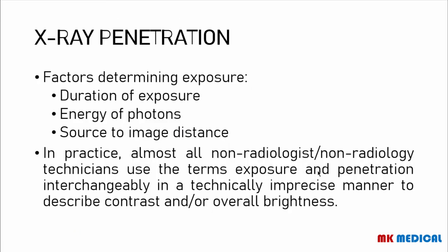So the last principle that we need to look at is X-ray penetration. The factors that determine the exposure of the X-ray film are the duration of exposure, the energy of the photons, and even the source to image distance. But these are technical terms that are going to be understood by radiologists and people studying radiology. For clinicians, I don't think this is very relevant for you.